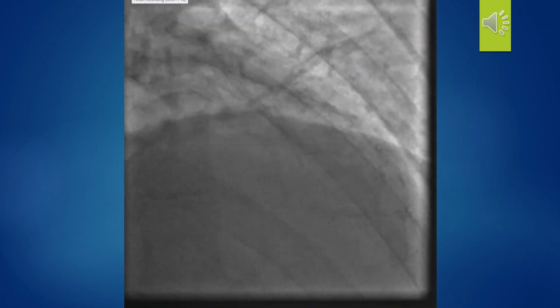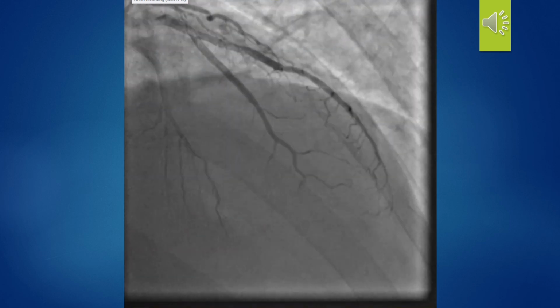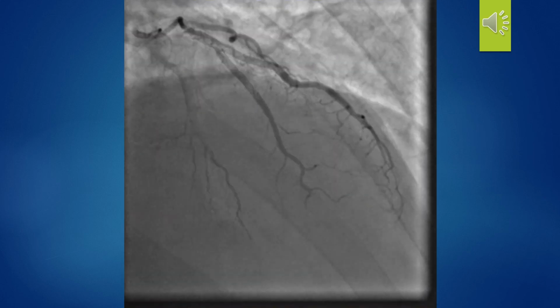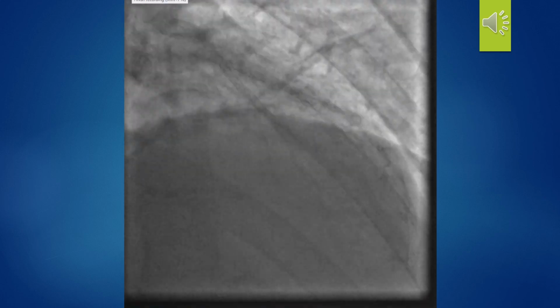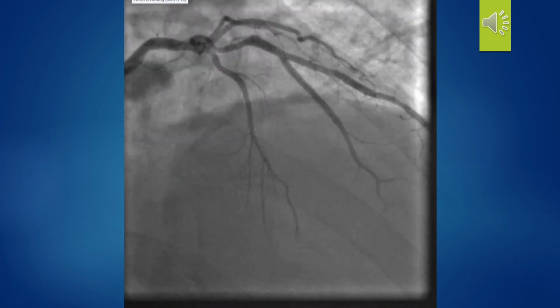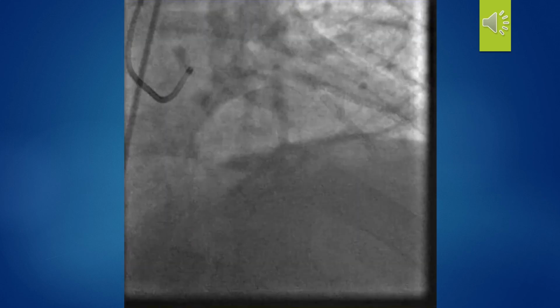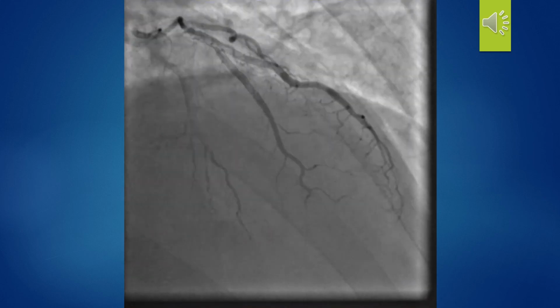The RCA lesion was staged 2 days later when we shot the left side again, and this is the final picture on the left side 2 days later, and you can see the distal LAD is very short, but it looks much better than 2 days ago, and the bifurcation stenting looks great.